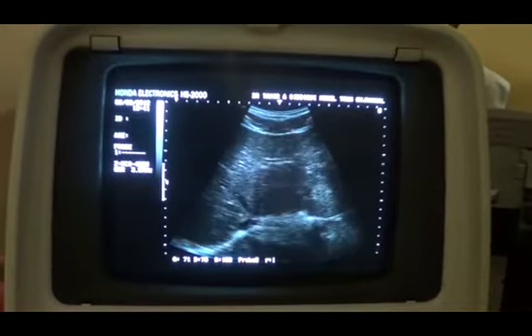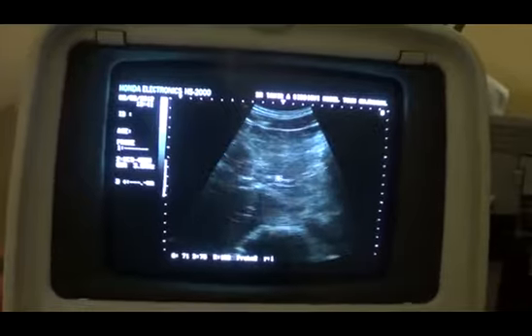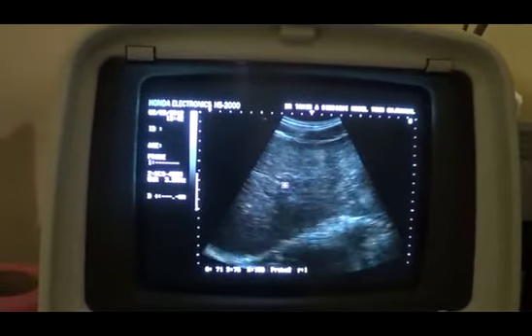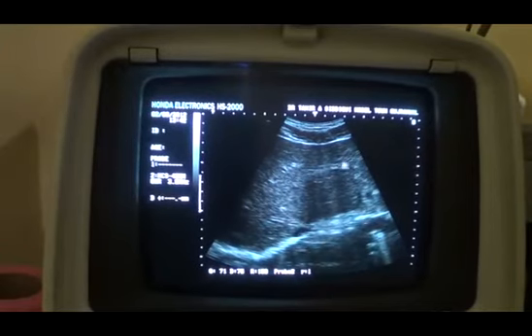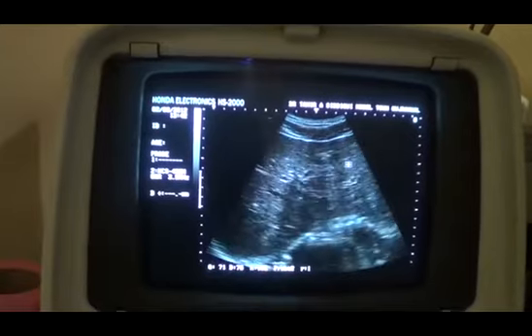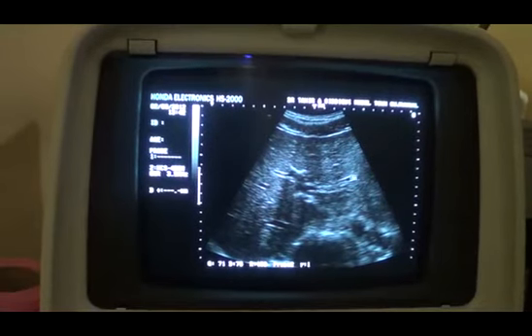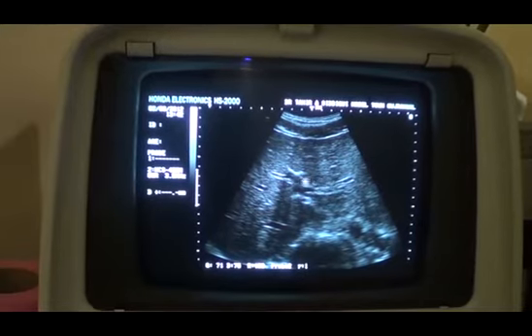This is the left lobe in transverse section. These are the left portal vein branches. One of the reasons for saying that the echogenicity of the liver has gone down, that the echogenicity is decreased, is that you see that the periportal echoes are very bright and prominent. See these periportal echoes.